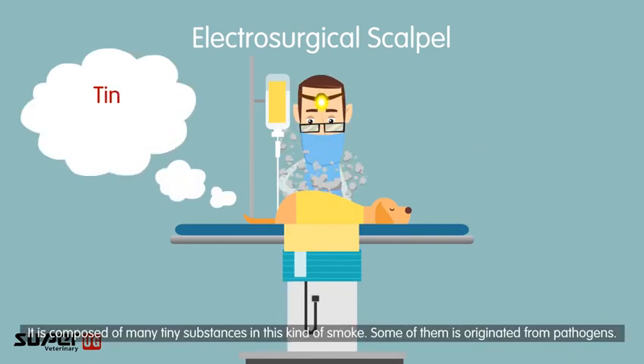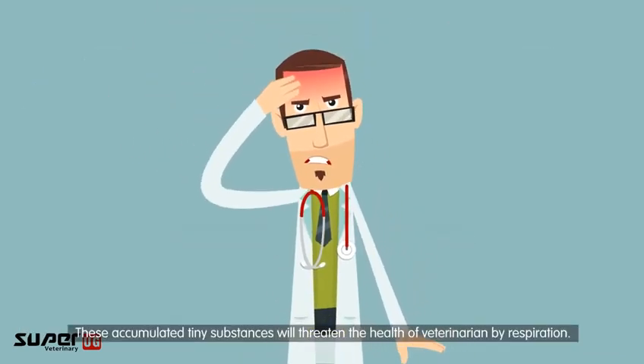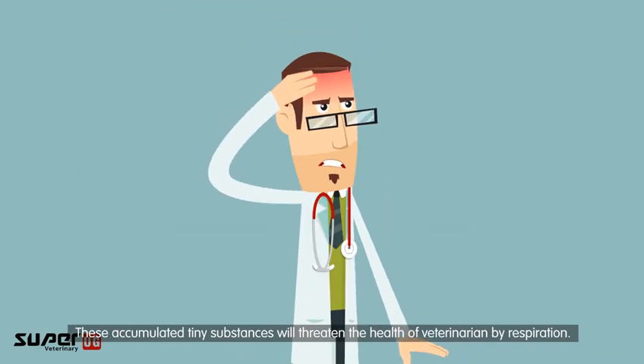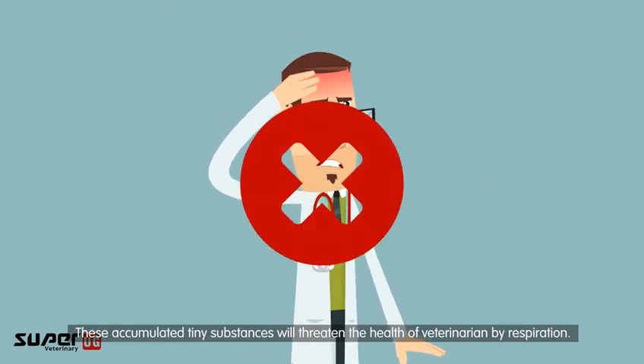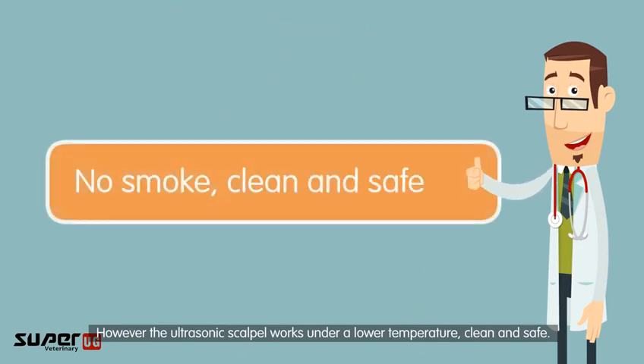The smoke generated by electrosurgical scalpels is composed of many tiny substances, some of which originate from pathogens. These accumulated particles threaten the health of veterinarians through respiration. In contrast, the ultrasonic scalpel operates at a lower temperature, making it clean and safe.